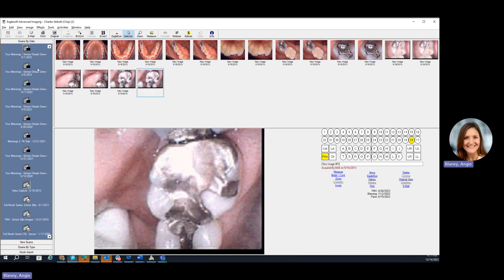Taking new images is easy depending on which sensors you use. I believe you do have the DEXIS, so you can definitely get templates set up on the left-hand side. When you go to capture a full mouth series, you'll have that template set up correctly so that your positioning of the x-rays are oriented correctly and exposed in the pattern that you want.